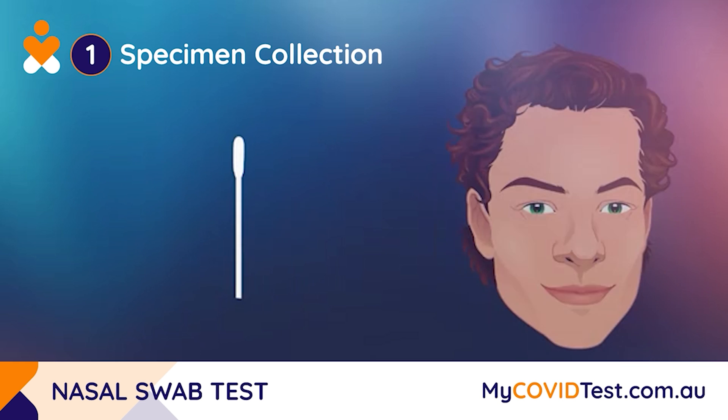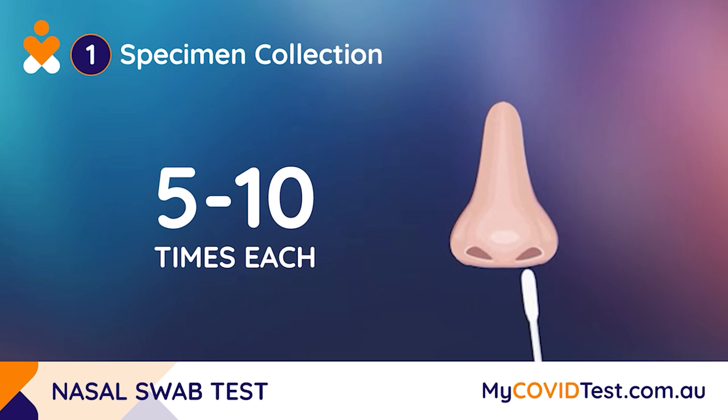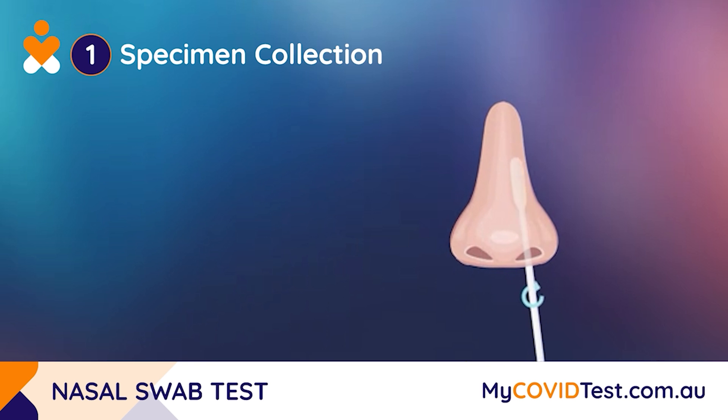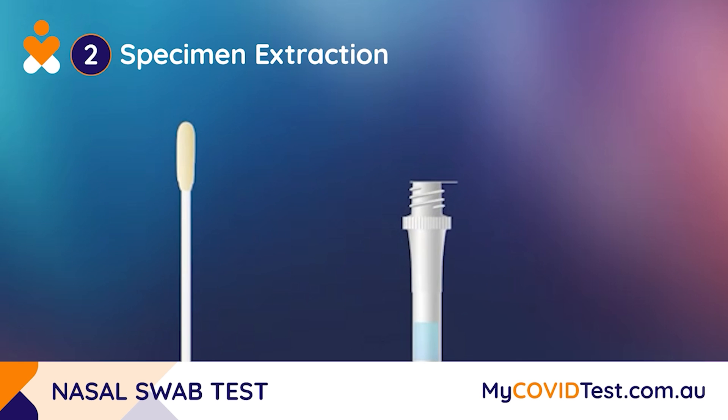First, take the collection swab and insert the padded end into your nasal passage, moving it around in a circular motion five to ten times. Repeat the same process in both left and right nostrils. Continue holding the collection swab upright whilst removing the seal from the collection tube.